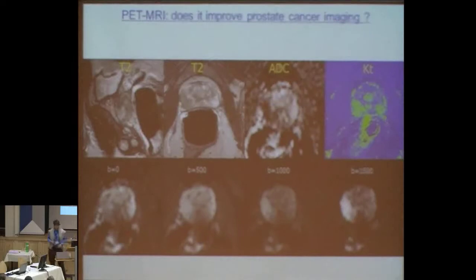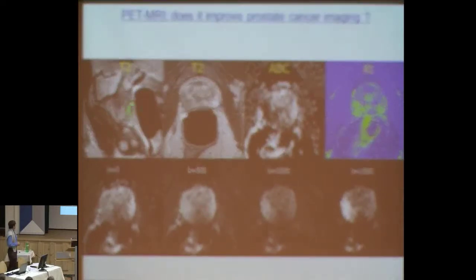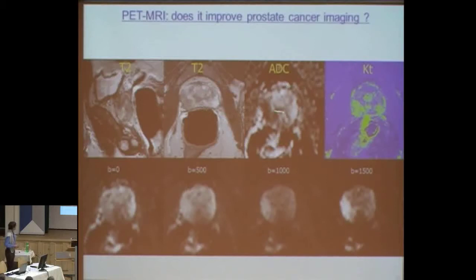Now a few cases to show you a bit these images that we get now quite often, fortunately. This patient is a young patient, 47 years old. This is maybe not such a useful case for PET MRI, but it just shows you what you get as images. These are the T2 images that you usually see. Profile, here this is very suspicious. Here on the right, sorry, this is very suspicious here. And here's the diffusion. You see it's all black here. The water doesn't move well. And here is the perfusion, and this is highly active.